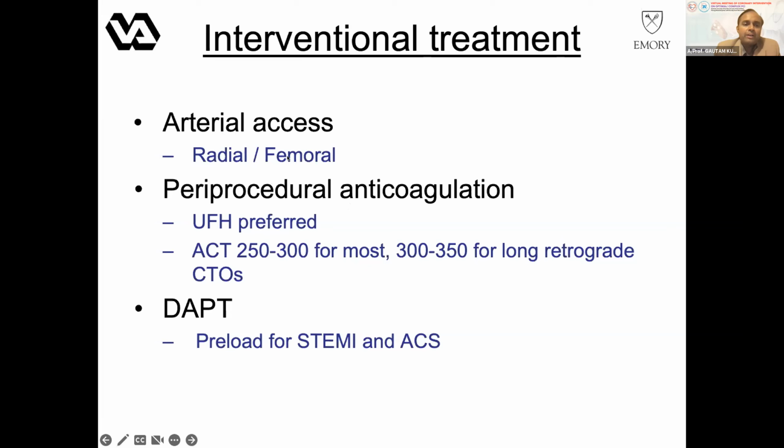In terms of femoral artery, it is important to familiarize yourself with micropuncture access, ultrasound guidance, and fluoroscopic guidance for obtaining access, to ensure that access sites are good, that you don't have a high stick or a low stick, and preferably that you're able to close these.